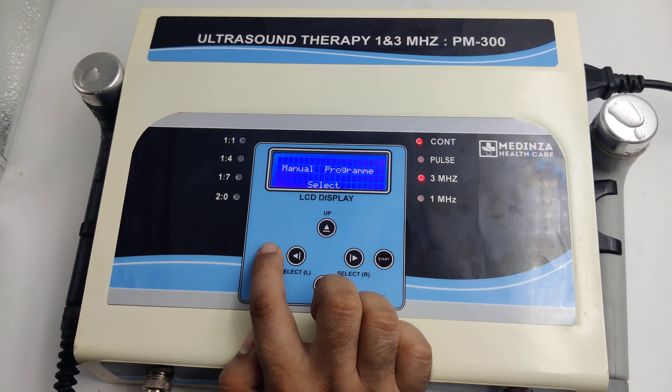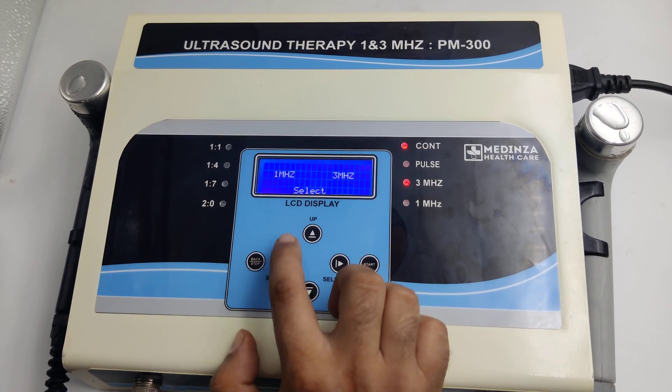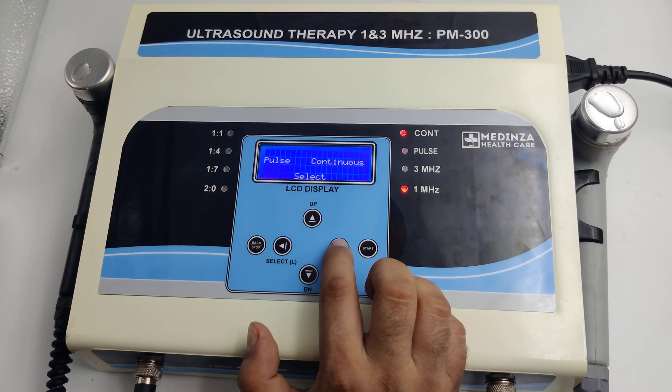If we are talking about manual program, go back and select manual. Choose frequency — 1 or 3 MHz — then select pulse or continuous mode. Here we select 1 MHz and continuous.